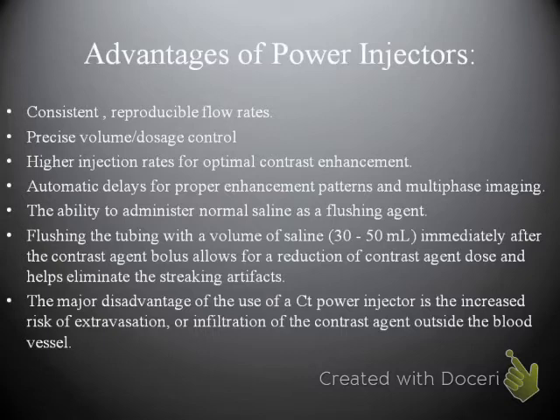If you're going at 3 milliliters per second and it takes you 2 or 3 seconds to actually become aware that infiltration has occurred, then all of a sudden you've injected almost 12 milliliters into the patient's extracellular space. And so it becomes very difficult to discern sometimes, and so it's very important that we understand that there are risks associated with the power injectors as well as benefits.